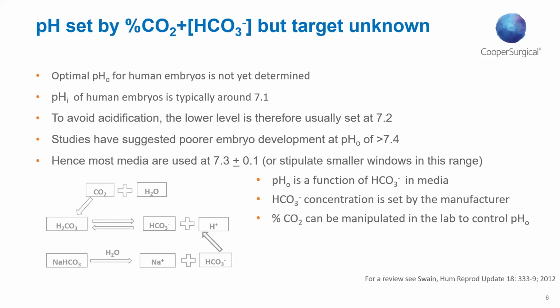And we have many stresses on the system that are going to try to change that pH and ultimately osmolality over time. Of course, the most important one is evaporation, which we need to be acutely aware of, not only making the dishes, but throughout the culture process as well.